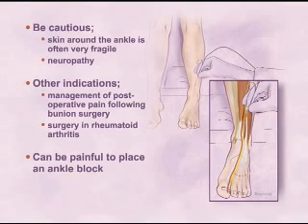It can be painful to place an ankle block, and liberal use of skin infiltration with a fast-acting local anesthetic agent such as lidocaine, injected slowly and with a fine needle, is advised. There should be no problem placing an ankle block in a heavily sedated or anesthetized patient. Never add epinephrine to the anesthetic solution.